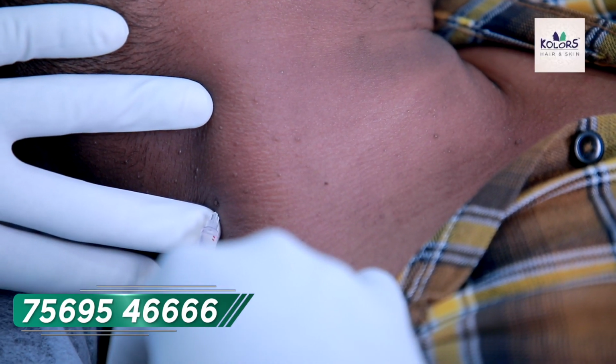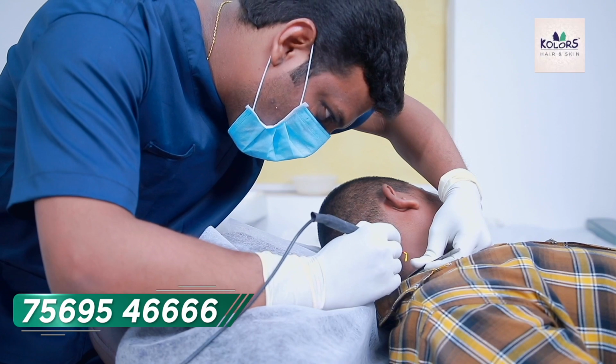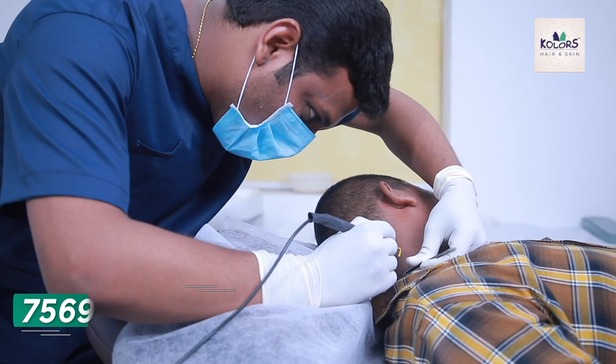Once the anesthesia has been given, either in the form of topical or injection form, next we have to clean with betadine. Then we'll be giving the injection anesthesia to the base of the lesion. Next we have to hold the lesion with the help of forceps. Then we'll be cutting at the base with the help of an electrode.